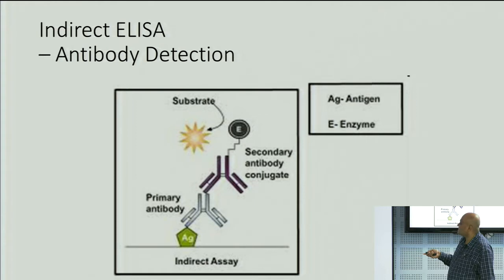If this reaction does not happen, if it does not change, then the result is negative. What you are detecting has to be connected to a particular type of enzyme, and your sample has to be connected to the enzyme and added, and when this reaction happens, you see a change. So this is more of a qualitative test.